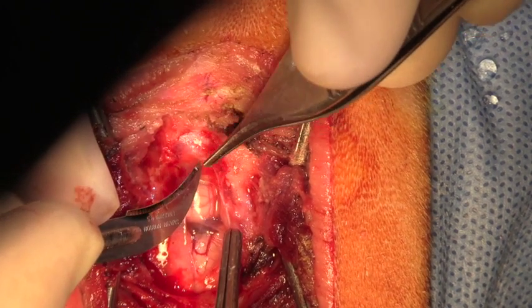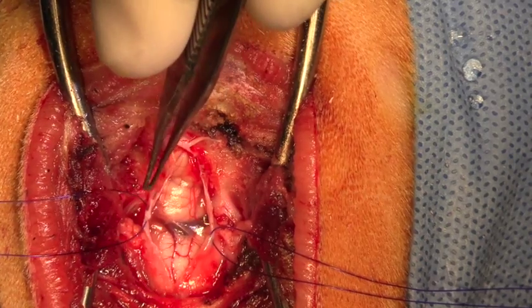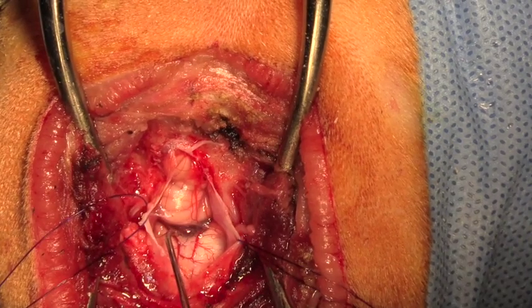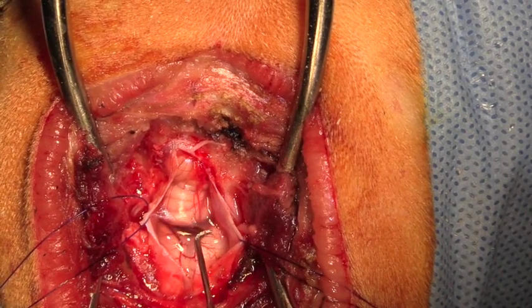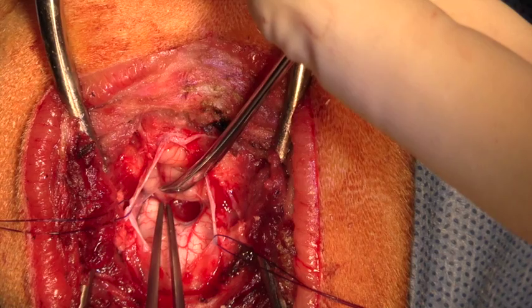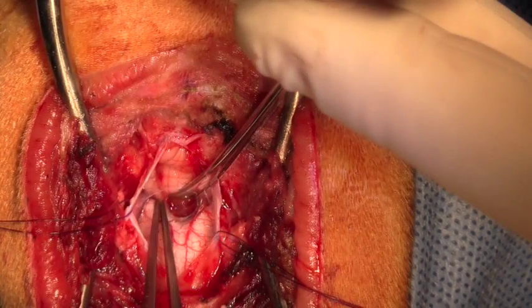The space between the ventral aspect of the vermis of the cerebellum and the funiculus cuniatus, which is the proximal-most end of the spinal cord, can be visualized. We're dissecting away the connective tissue which is probably arachnoid in that space, very carefully cauterizing blood vessels that are lying between the funiculus cuniatus and the vermis of the cerebellum.